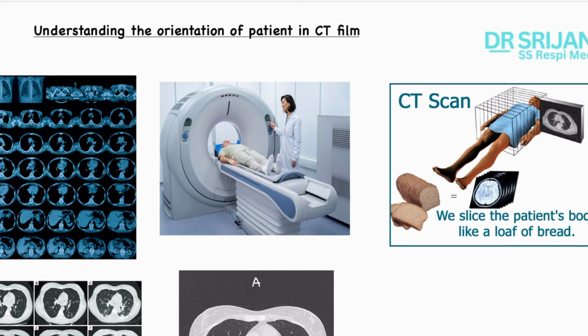Here, you must remember that the patient's foot end is projecting. Whenever you are seeing a CT scan plate, always imagine that the patient's legs are projecting towards you, outside the plate, and the patient's head is far away, or just the opposite, behind the plate.